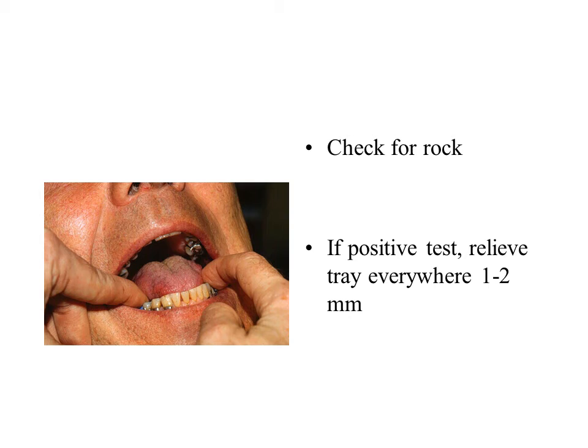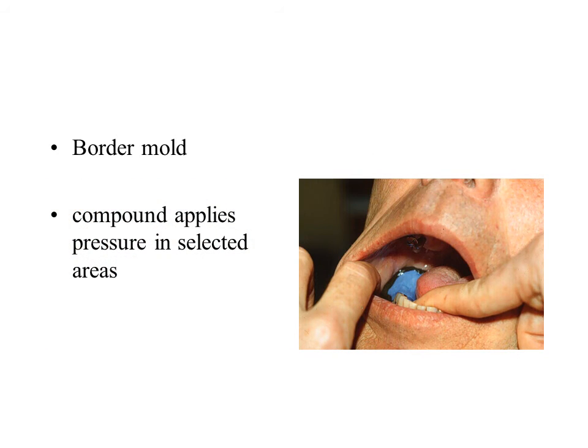The impression is open mouth. The patient moves the tongue from side to side and opens and closes. Gently hand manipulate the cheeks. It is necessary to maintain the tripod of rests in place during this procedure.